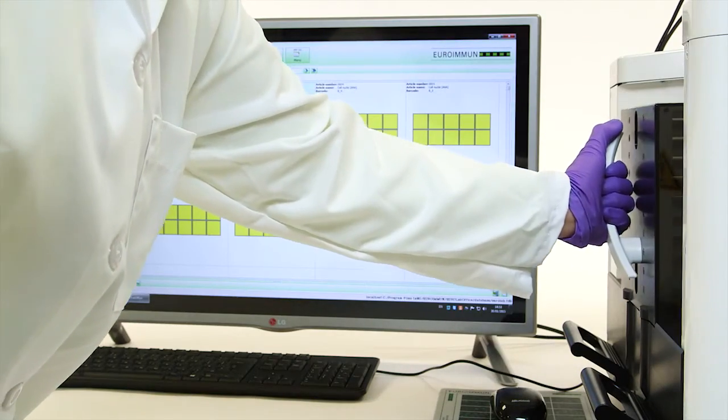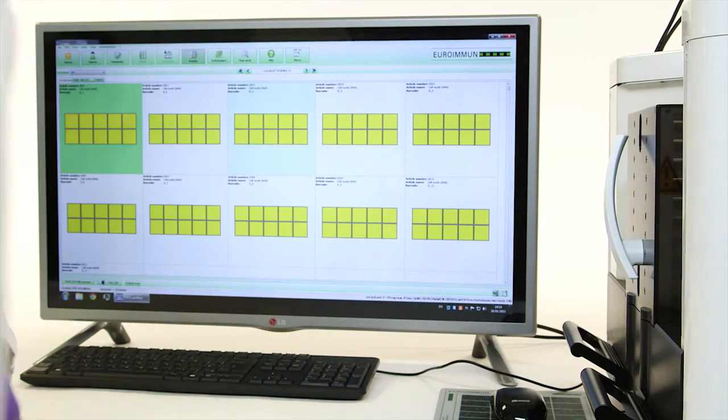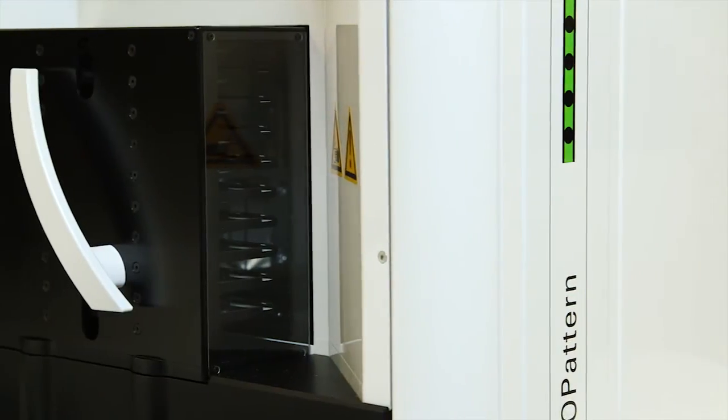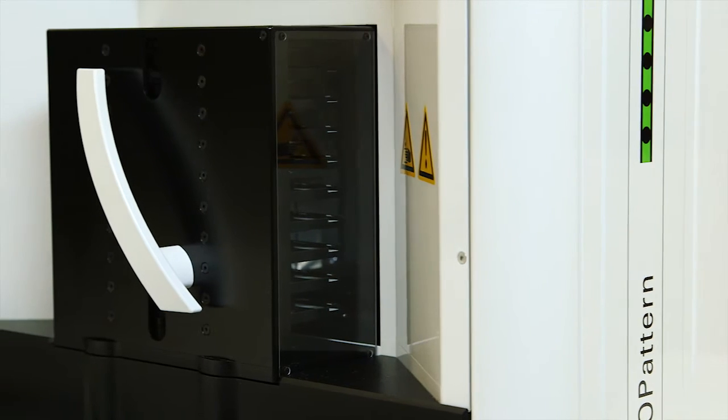Once loaded, place the magazine into the Europattern. You are now ready to begin processing the run.